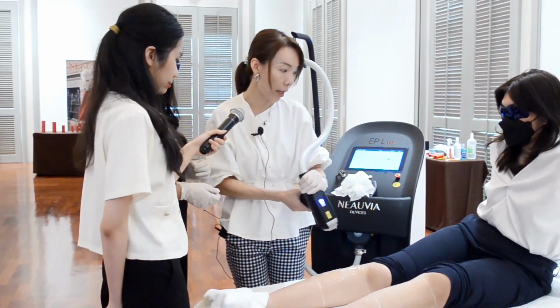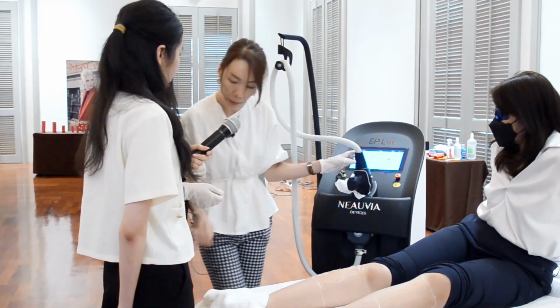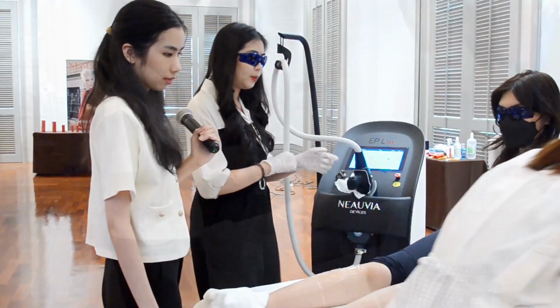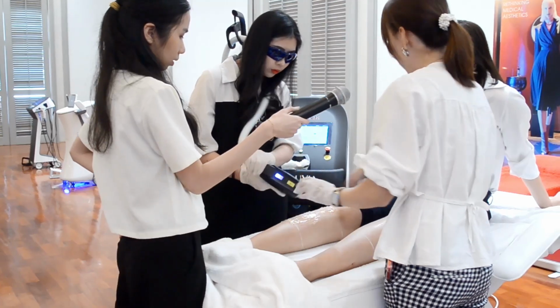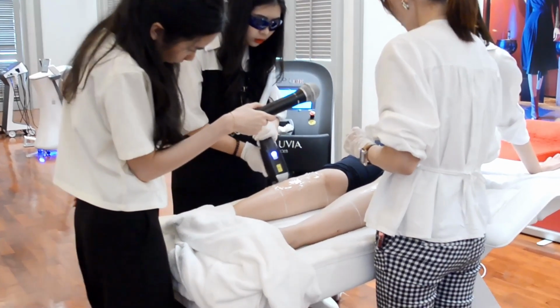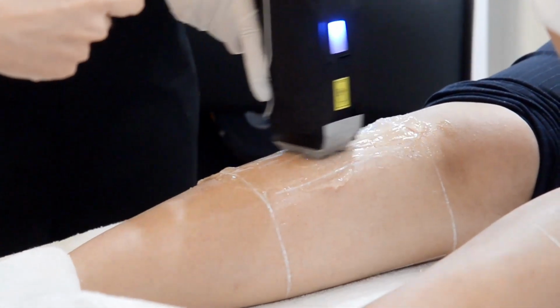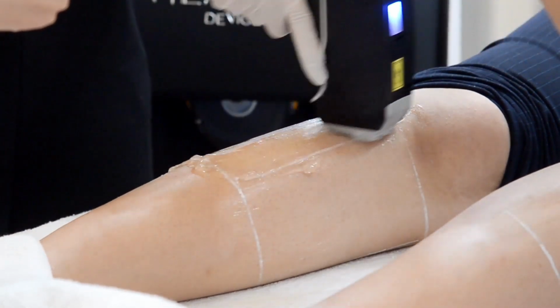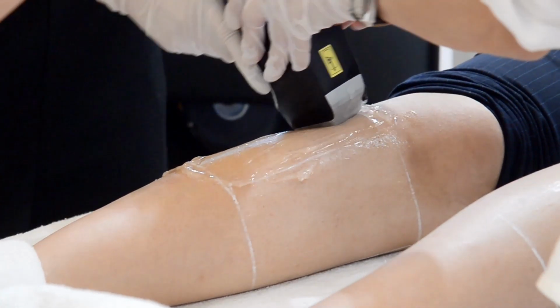Is that okay? Maybe I think it's too low for you. Let me raise up the bed. Okay, so don't turn it on yet. You just try the gliding motion first to be familiar. Your wrist has to be very flexible when you're moving, because at all times the device has to have full contact with the skin.